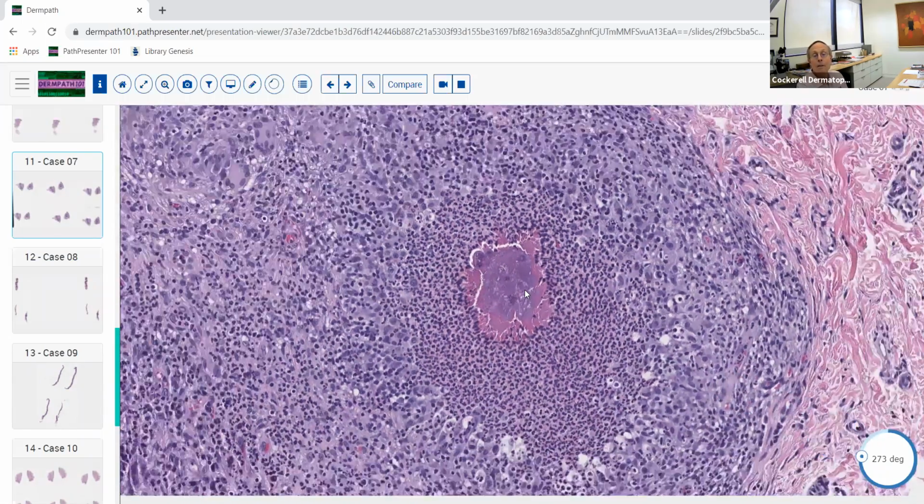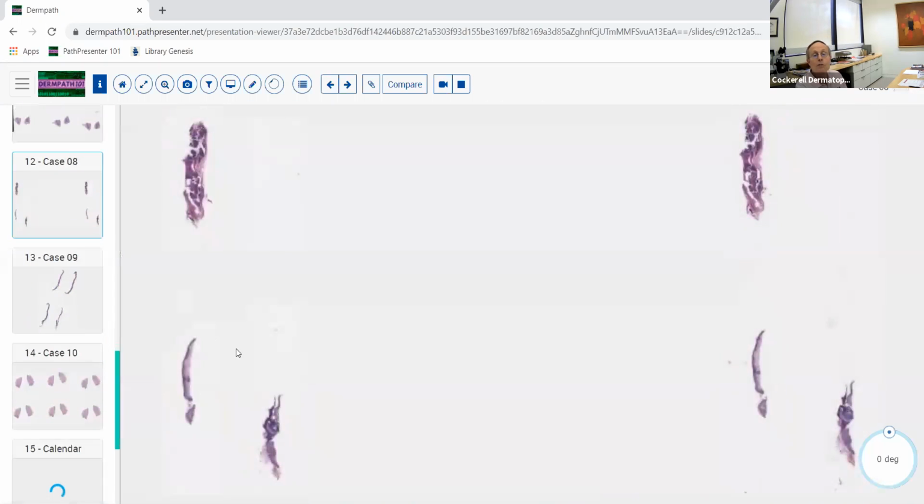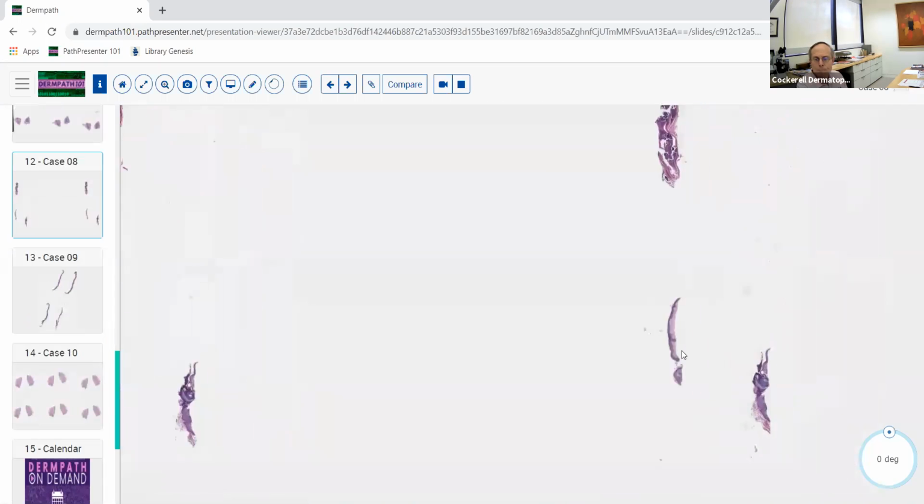But nocardia is thought to be a sort of primitive bacterium, so it would fall into this bacterial theme we're talking about today. But basically, make sure you know your grains, make sure you realize the differential diagnosis of the grains and granules of tissue that can cause this pattern. Notice it generally tends to get a suppurative granulomatous inflammatory reaction.